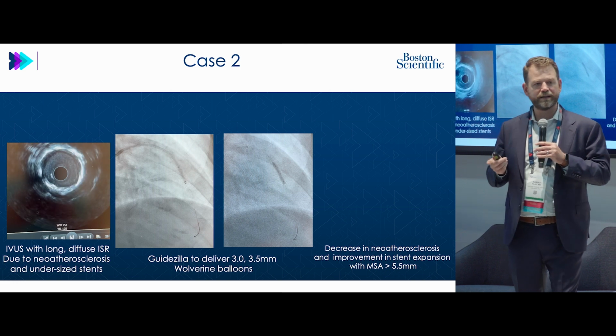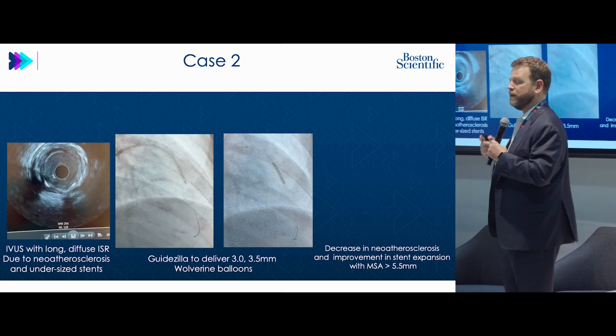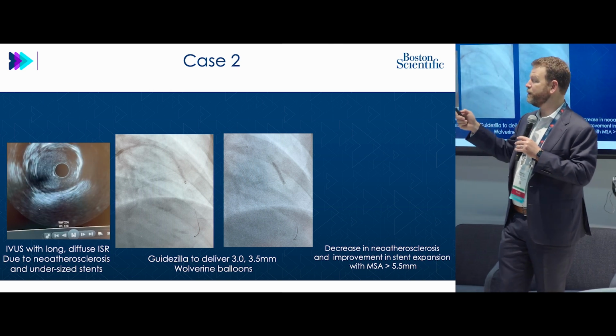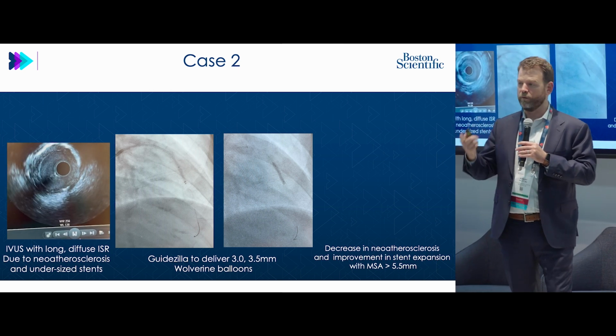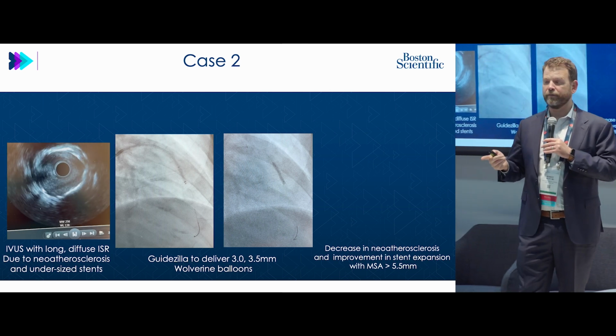Does this take away the drug's efficacy? Possibly. So anytime you get an indicator with your IVUS that there's going to be an issue, you'd want to preload with the guide extension. But one of the things I really like to do is unsheathe my instruments, like my Wolverines, my agents and things like that, because again, I want to make sure it's going to get there the first time.